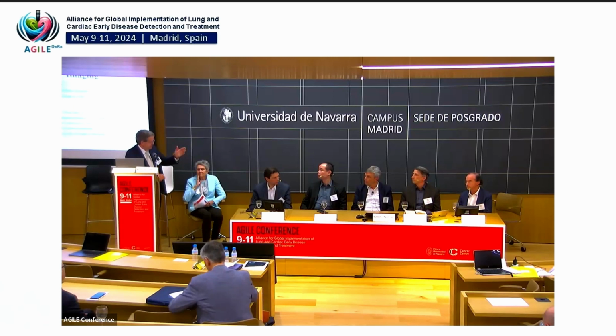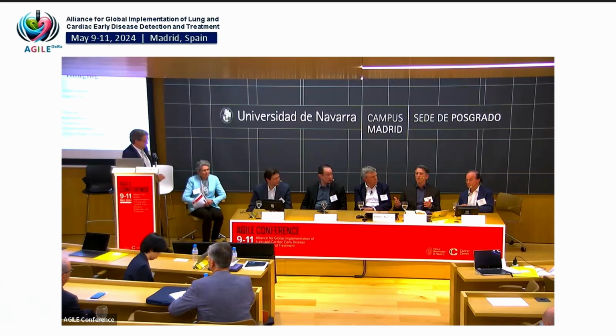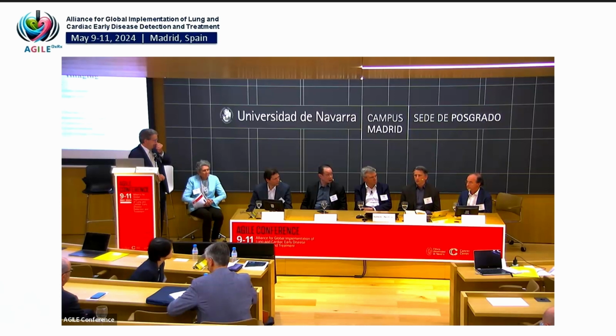I can jump out of order just real quickly. Sean, any comments in that regard? Yeah, I'm slightly more optimistic than Rick, I think. In our profile, we inherently designed the profile to also allow high resolution imaging of the airways. So there was both the quantitative density aspect, but also in the back pocket, we were always thinking we wanted to quantify wall thickness and lumen area. So while it's a challenge, I agree, for the same reasons that Rick outlined in terms of noise, it is possible to balance both accurate density measurements and high resolution.